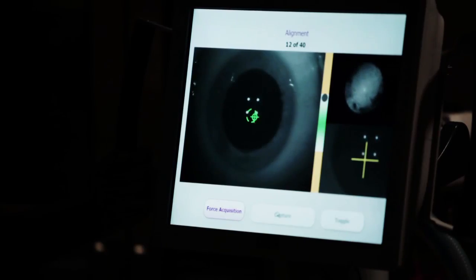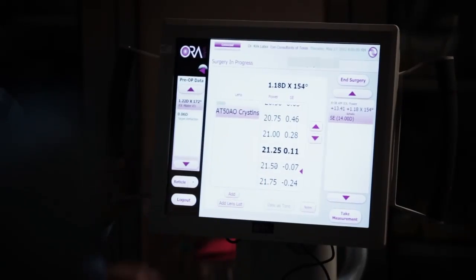Capture. Straight in front of you. Right there. Very good. Keep looking. Great.